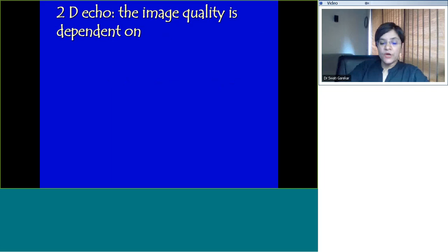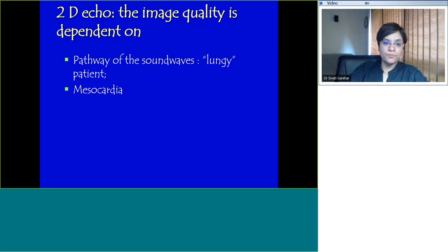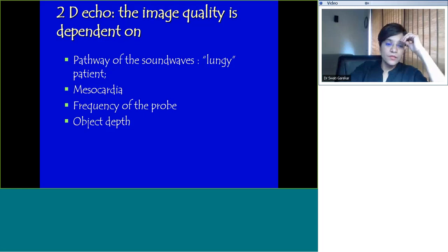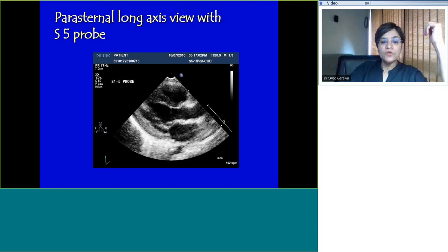Going back to a discussion on the physics of 2D echo. The image quality is dependent on the pathway of the sound waves. If it's a lungy patient, a lot of air in there, then you will not have good pictures. If your heart is behind the sternum, obviously that will be bad. The frequency of the probe and object depth also impact the image quality. Here's looking at a parasternal long axis view with an S5 probe. This is in a smaller child, an infant. You can see the heart beating properly and you can make out all the cardiac structures.